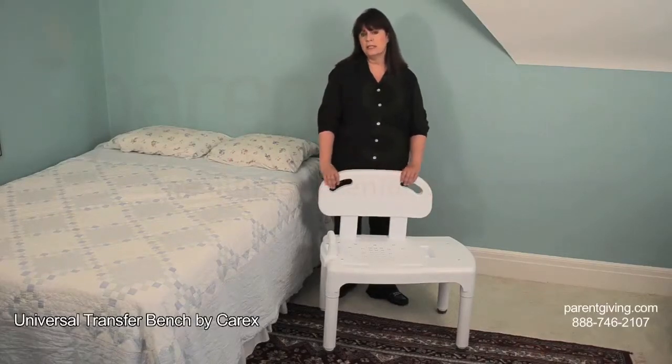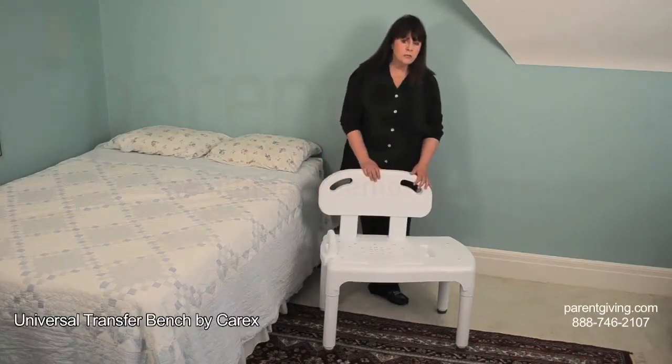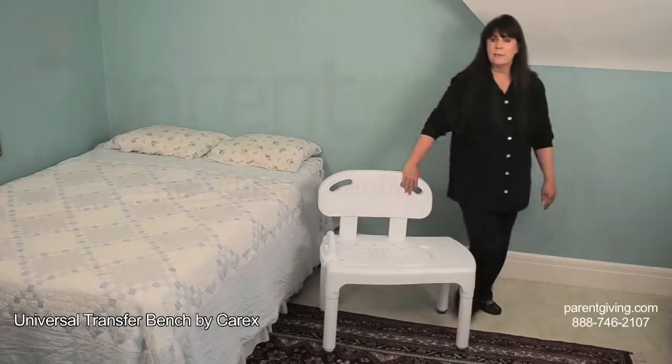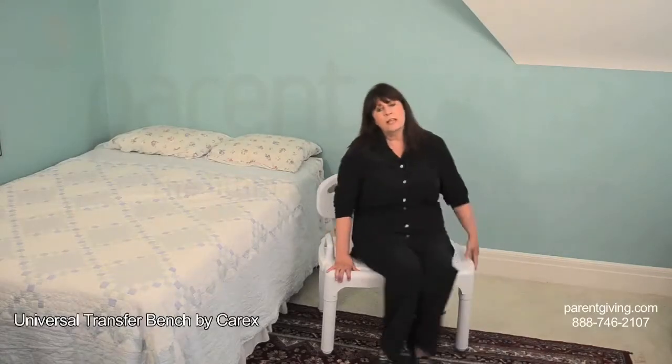You can assemble it and disassemble it quickly for travel or when you want to move it out of the way. To use it, you place two legs on the outside of the tub and the other two on the inside. Then, instead of having to step over the side of the tub, you sit down on the outside edge of the seat and swing your legs inside.